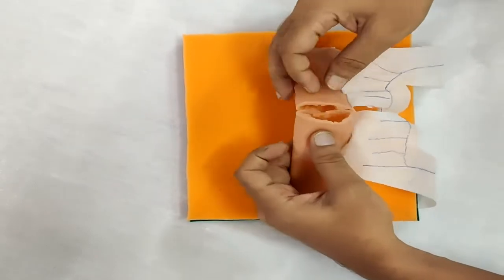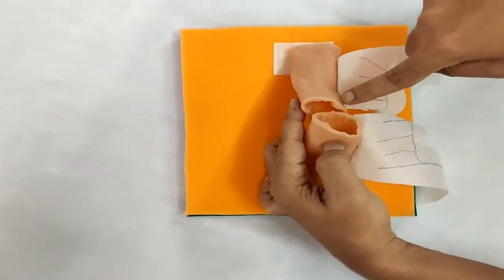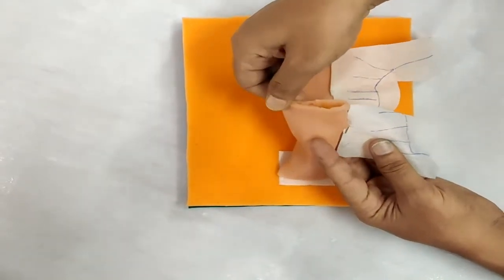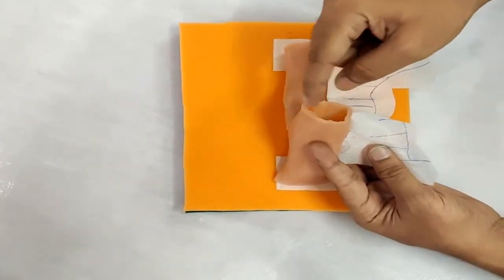There are certain principles that we need to follow. We have to identify which is the mesentery border and which is the anti-mesentery border, because the suturing principles will involve these two ends.